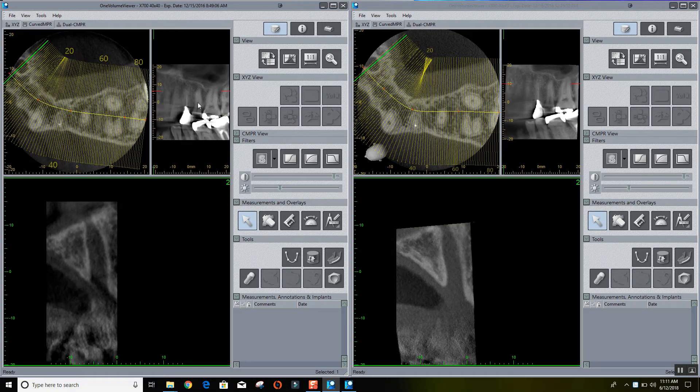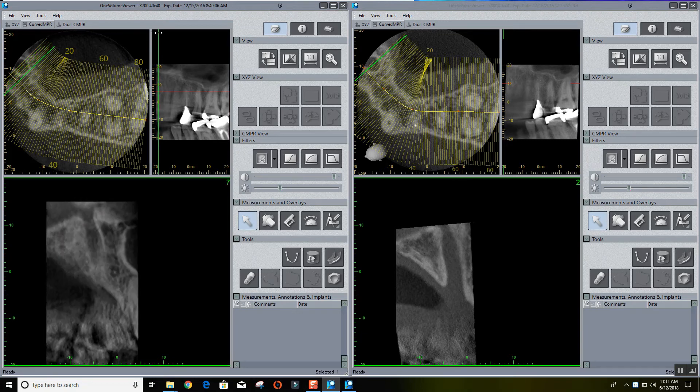Finally, we have drawn an MPR curve in each scan so that we can move along the arch slice by slice and compare the images from each scan that way.